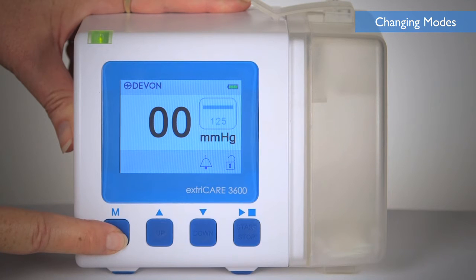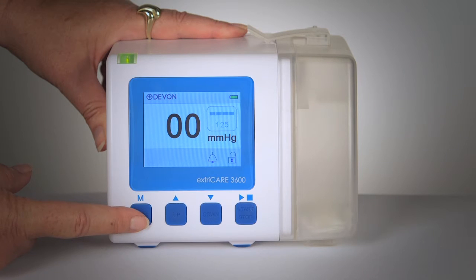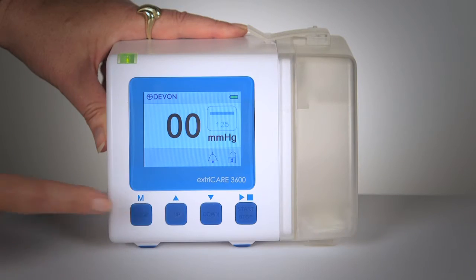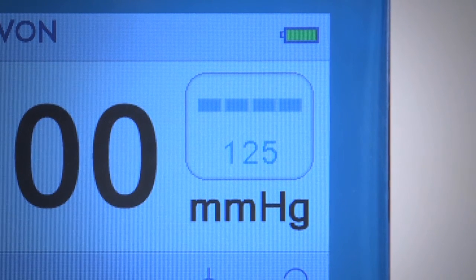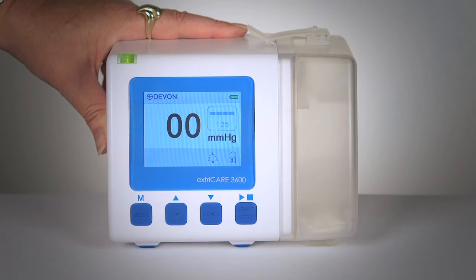To change the operating mode, press and hold the mode button until the mode icon changes. The ExtraCare 3600 can operate in continuous or intermittent mode. If operating in continuous mode, a solid line will be displayed on the screen and the device will operate at the pressure set by the user. If the device is operating in intermittent mode, a dashed line will be displayed on the screen and the ExtraCare 3600 will operate for 5 minutes at the set pressure, then for 2 minutes at 20 mmHg, and then will repeat.